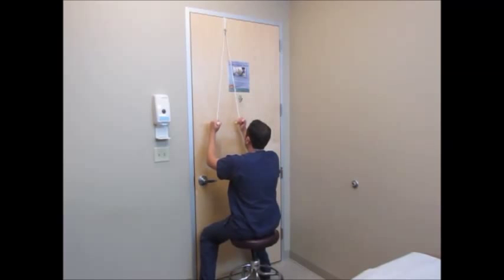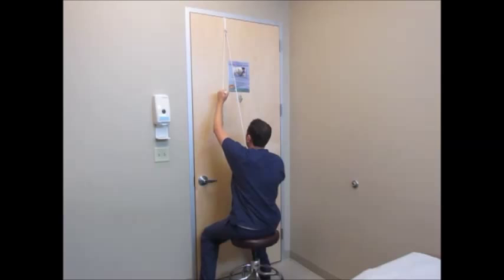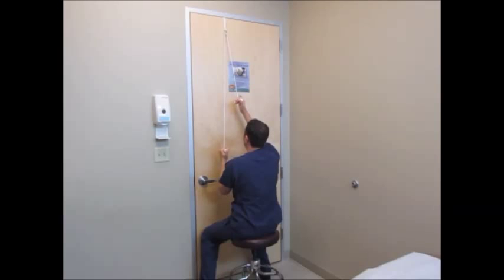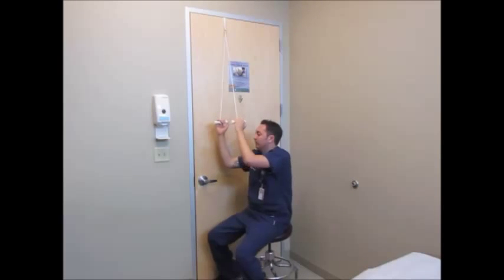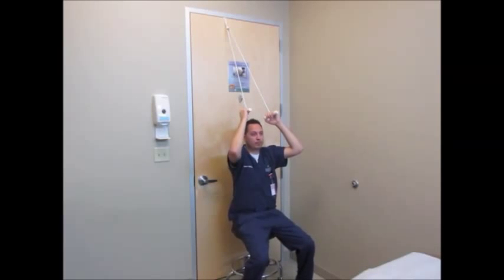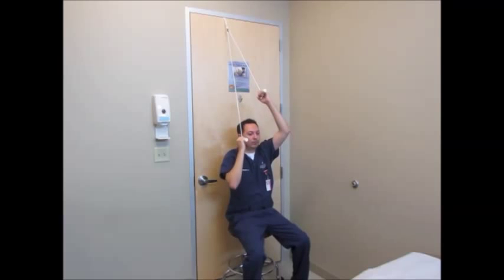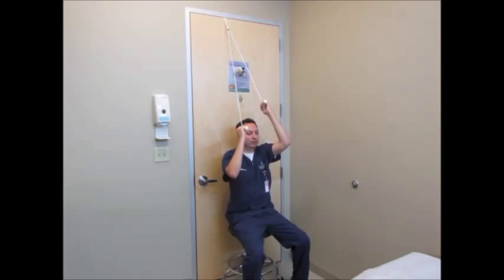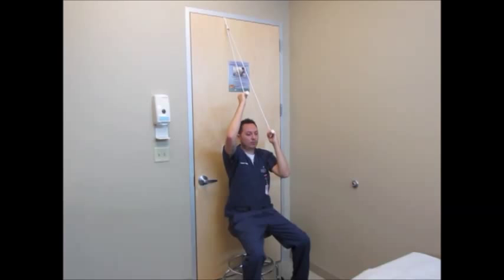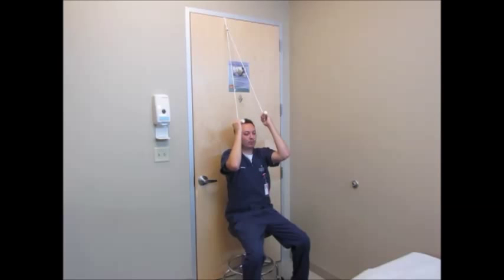When you first start these exercises, face the door and the pulley — this is a little bit easier. We're going to assume we operated on his left shoulder, so he grabs it with his left hand, keeps the shoulder muscles relaxed, and uses his right arm to pull that shoulder up. We'll instruct you on how far to go — usually between 100 and 130 degrees when you first start. Once you get further along in rehab, turn your back to the door. As he pulls the right arm down, the left shoulder goes much further, up to almost 180 degrees. Remember, don't use the muscles in your left shoulder — everything is done with the right shoulder and arm.